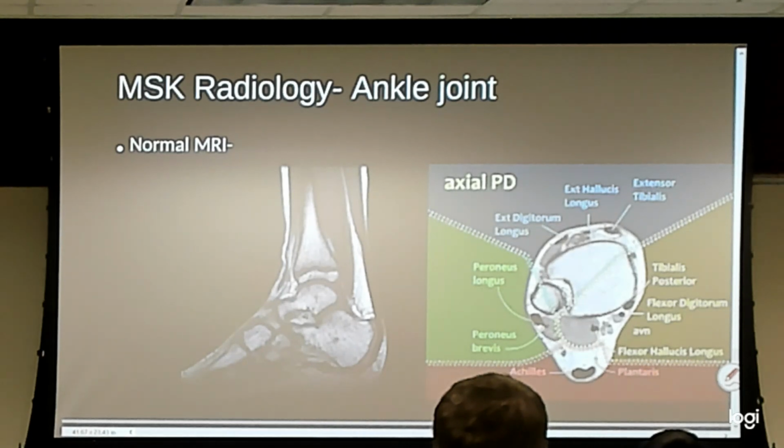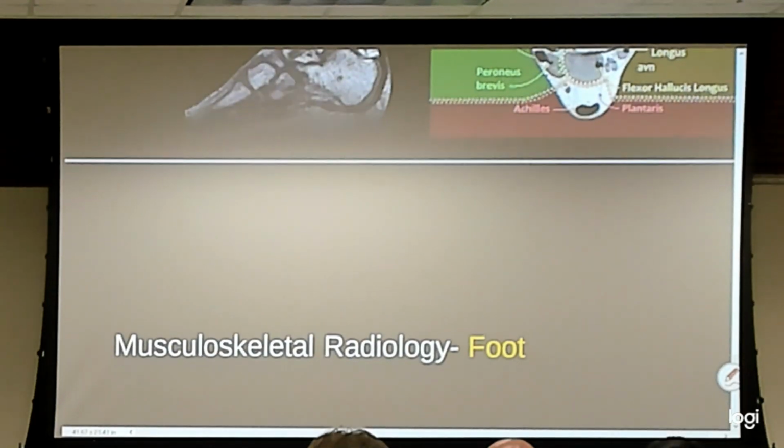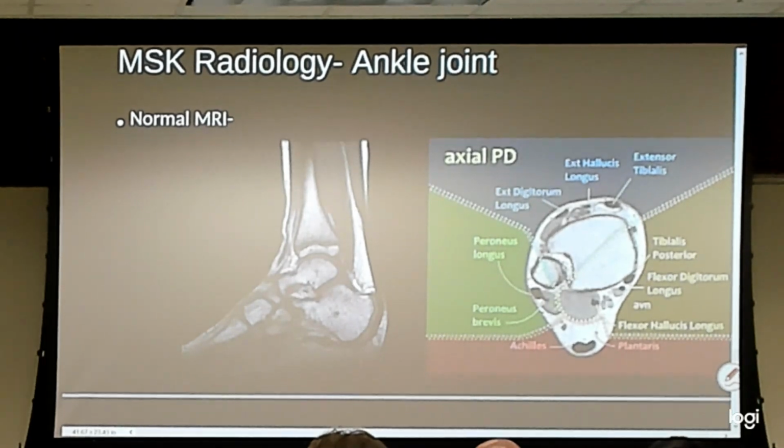What would I use this for? Ankle sprains with laxity, where I'm thinking that one of the ligaments is out. I would prefer an ultrasound over an MRI if I thought their Achilles was out. Lisfranc ligament. So some of the ligaments are my preference here. I would go ahead with that study. I guess you could look for a gastroc tear. So I was coming back to that image that's on the right there. We were looking at something wrong with gastrocnemius. So we could capture that in an MRI as well.